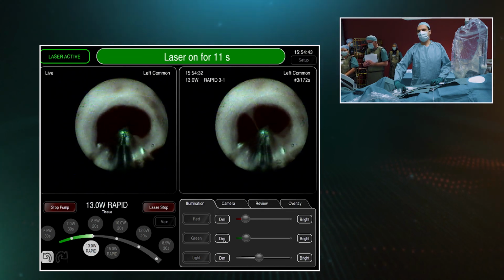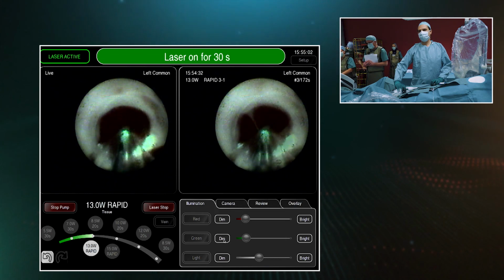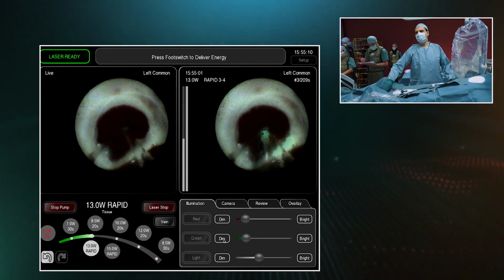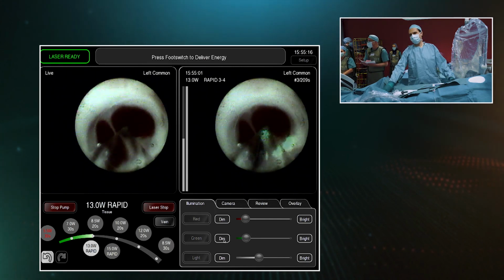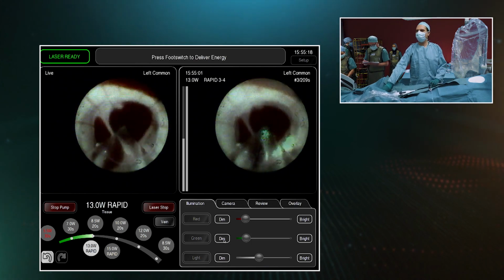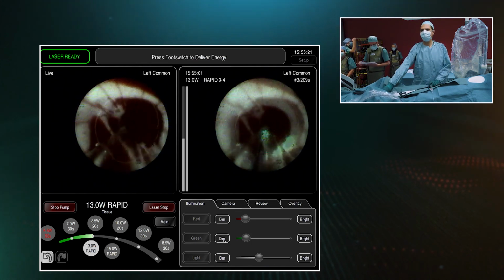And you can see where we started the lesion. You can see where the white discoloration starts, and that's where I want to stop my lesion. There, we'll go for some extra overlap. Extra time needed is 5 seconds, and it's going to make sure we don't need to come back here. There we go. Okay, here we can deflate, and we should have isolated the entire left portion in one single circle.